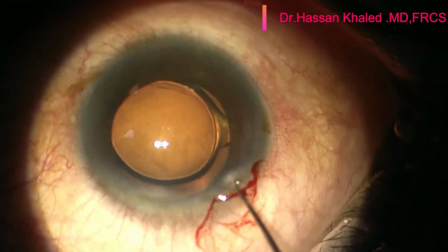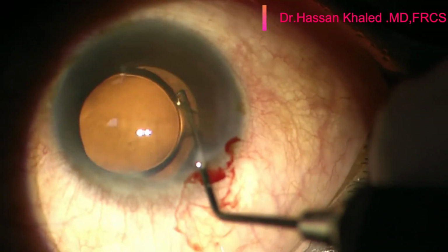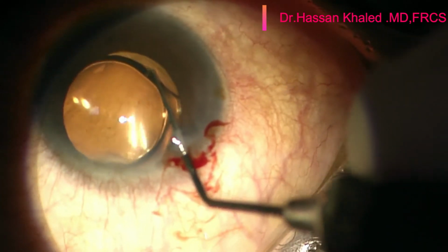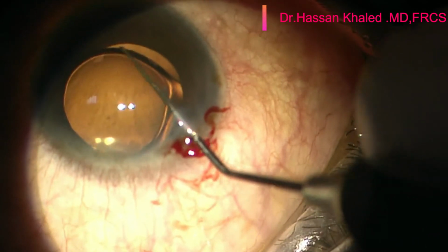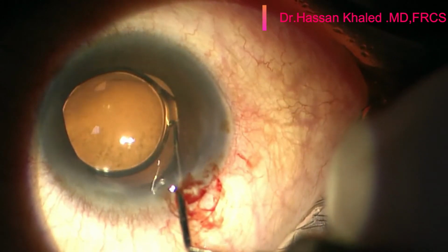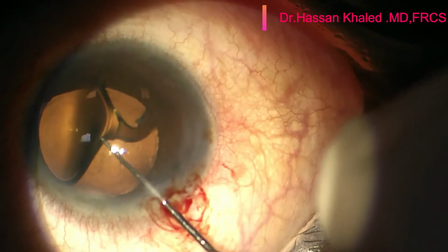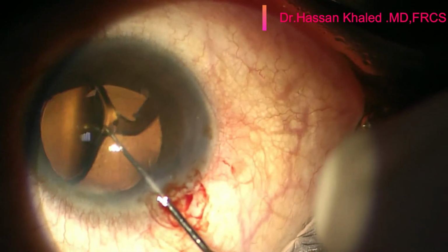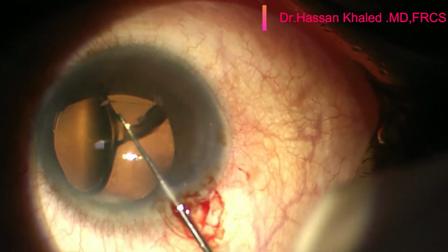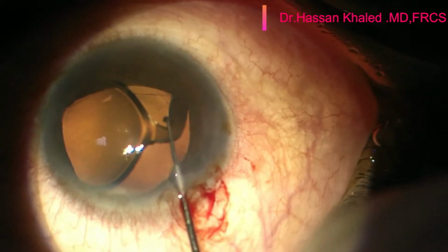Then Sinskey was used to free the haptic and pull it out slowly and gently from the capsular bag into the anterior chamber on both sides. This is a very crucial step and should be done smoothly, and it is very important to be sure that the haptic is completely free from the capsular fornix to avoid any zonular dialysis.